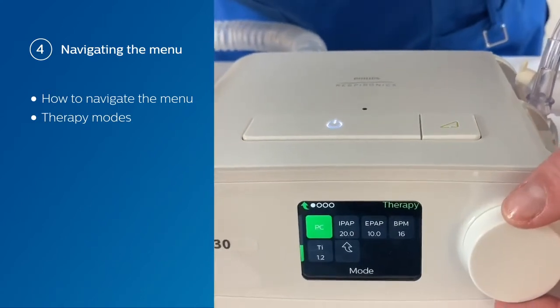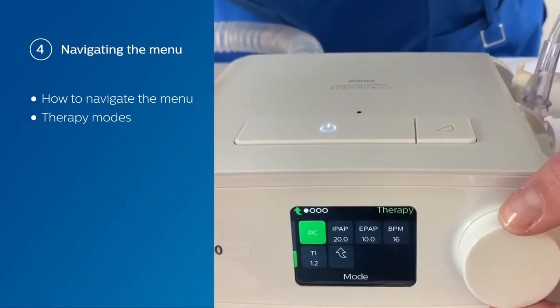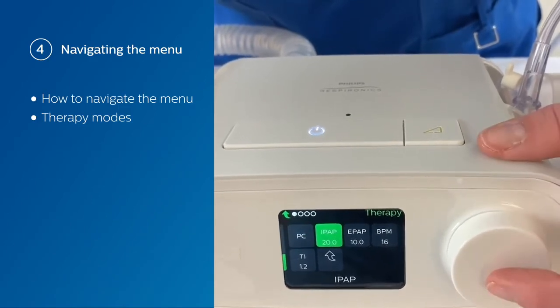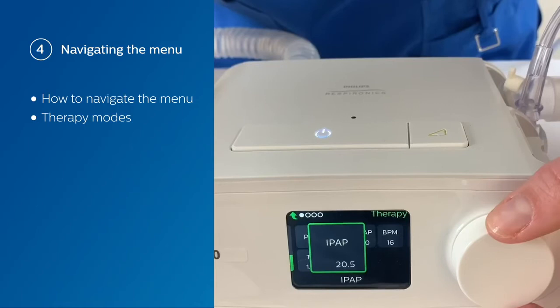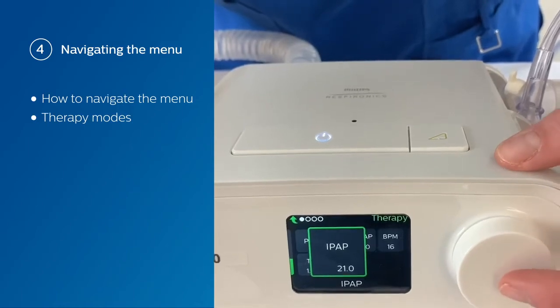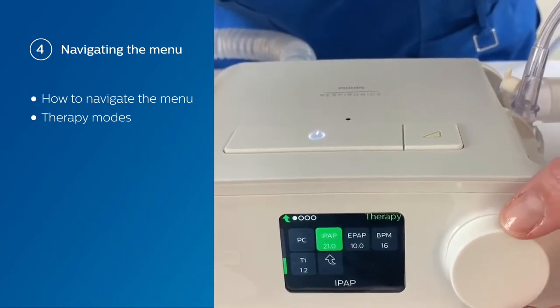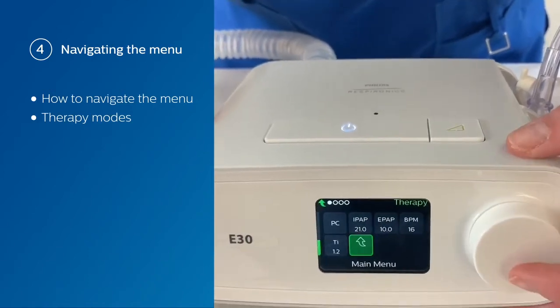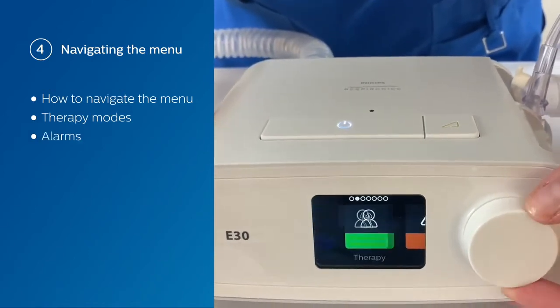So if we like these settings, we can start therapy like this. Or, what we're going to do is scroll over and change our IPAP to the desired level that we want. Now we're going to scroll down to our main menu and set up our alarms.